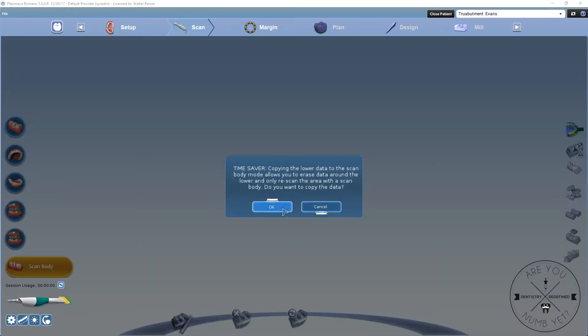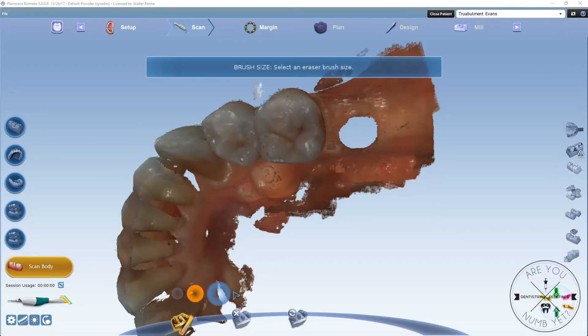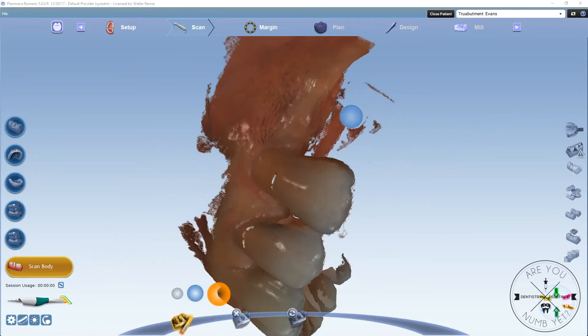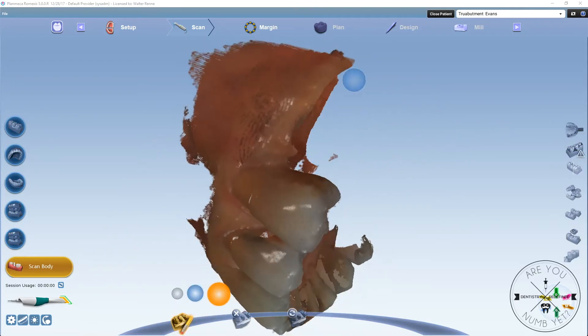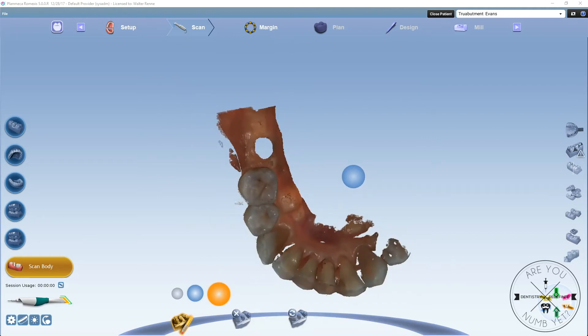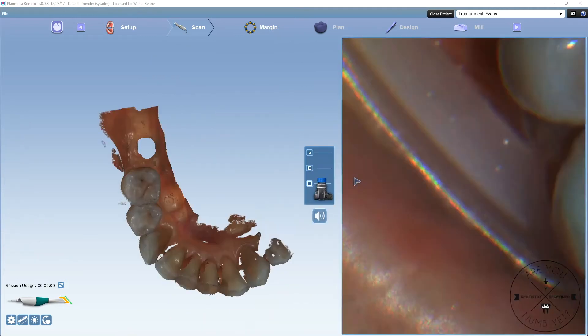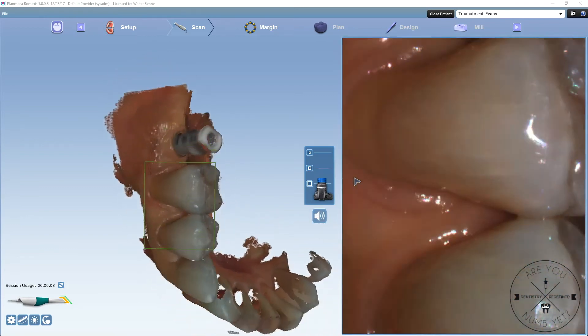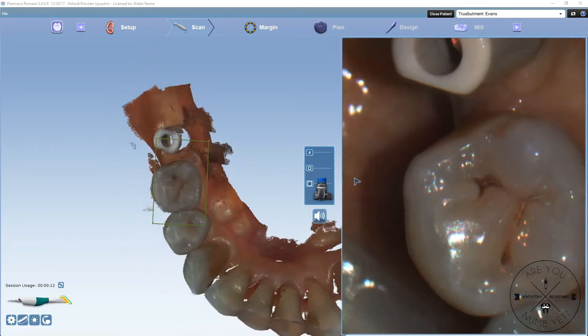Once you have that, you could copy it down to the lower, or in the next version of the software, you'll have a scan body tab that you could scan under. It doesn't matter. You could do this right now in basically any version of PlanCAD Easy.